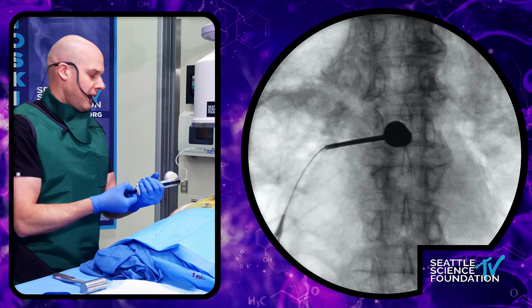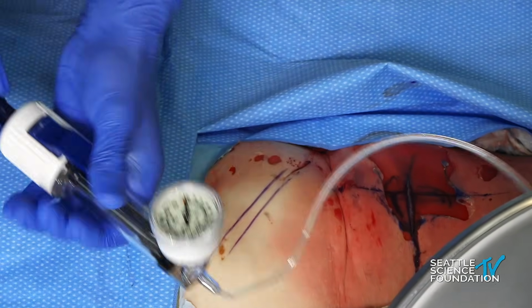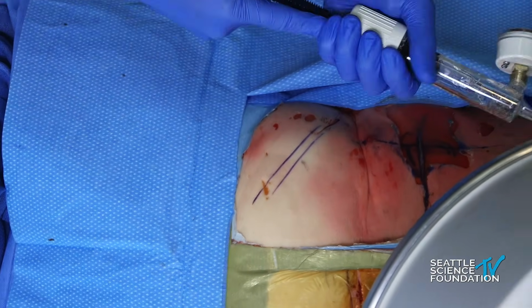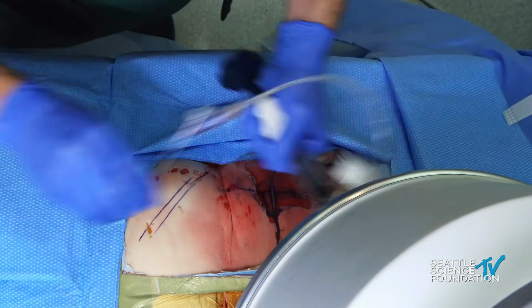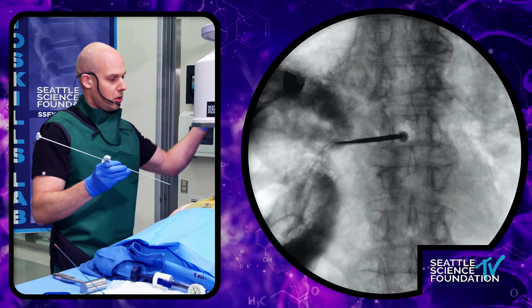So we're going to deflate the balloon here. All right, and now we have the bone filler. So what we'll do, we'll go lateral.